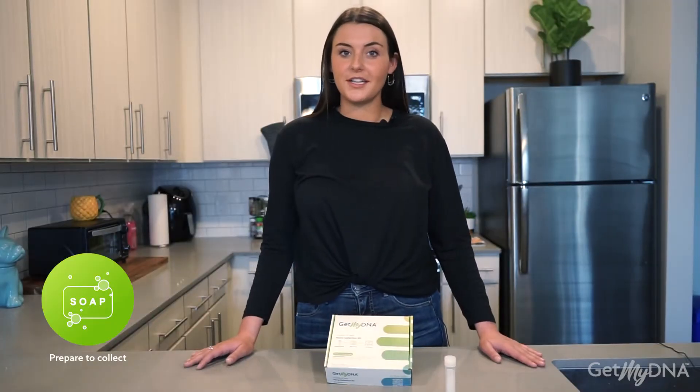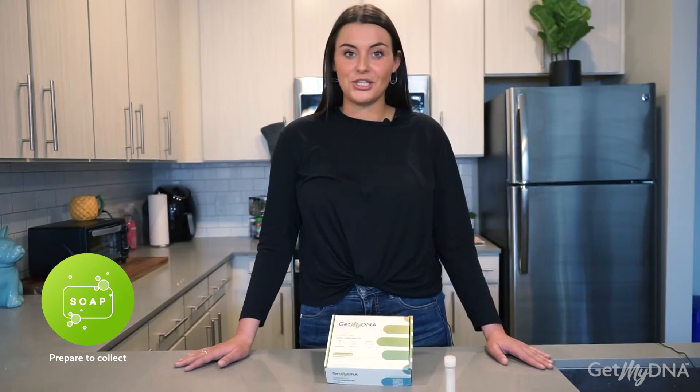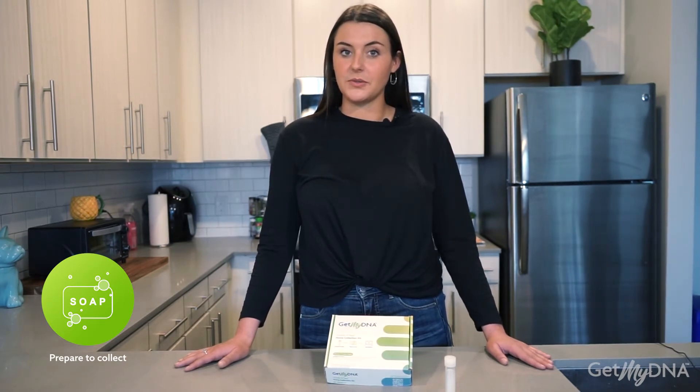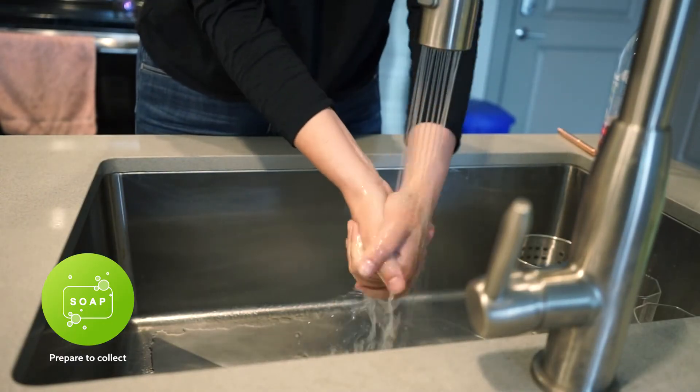Before you start the collection process, blow your nose and sanitize your area. Make sure that you do not use the two alcohol prep pads provided in your kit — these items will be used later on in the process. Then thoroughly wash your hands for a minimum of 20 seconds.